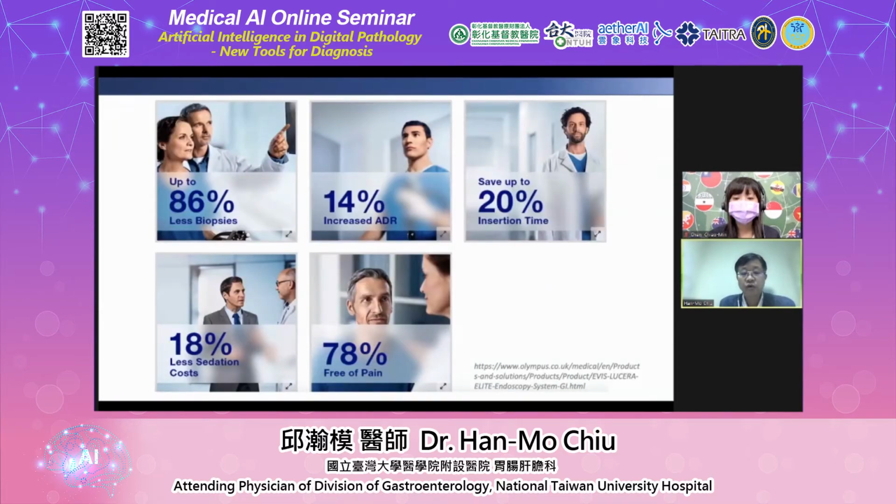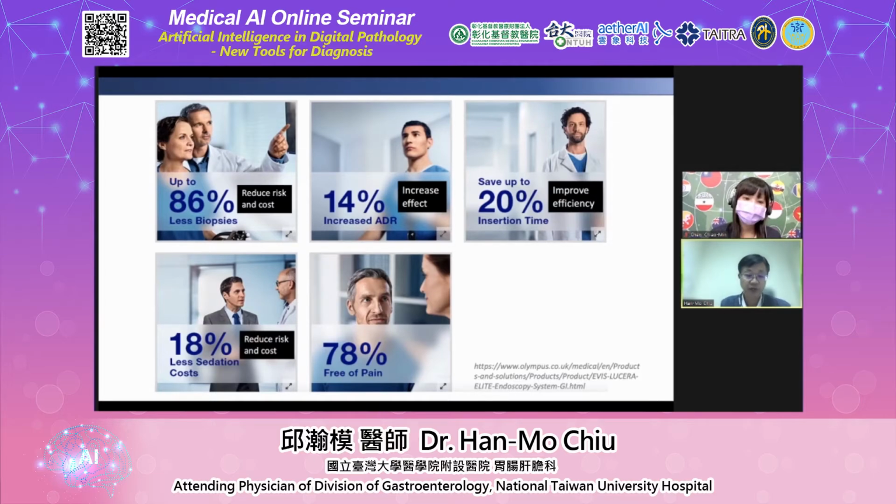Whether colonoscopy could detect as many polyps and accurately diagnose their nature are associated with its effectiveness in preventing colorectal cancer, avoiding unnecessary complications, saving money, improving the efficiency of the workflow, and improving patient experience, which is closely associated with screening uptake. As such, it is the right time to think whether state-of-the-art artificial intelligence technology could play more role in those aspects other than ADR.